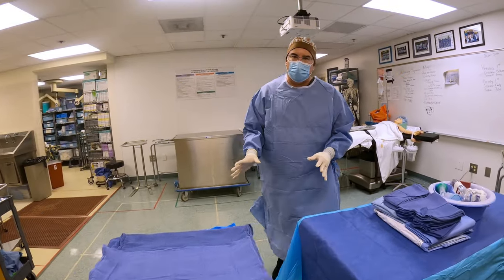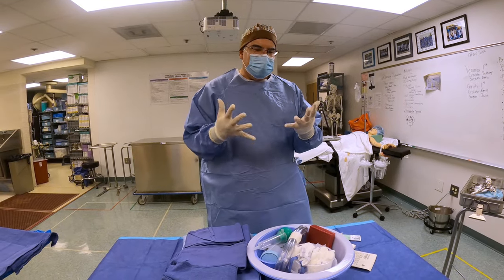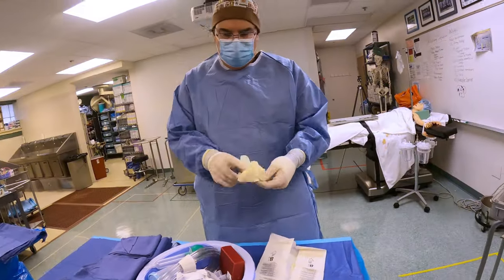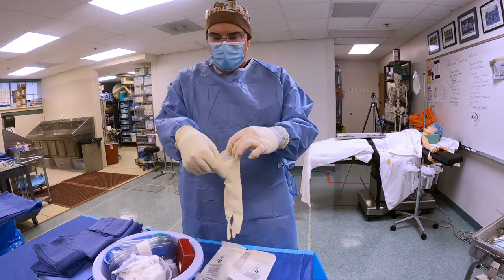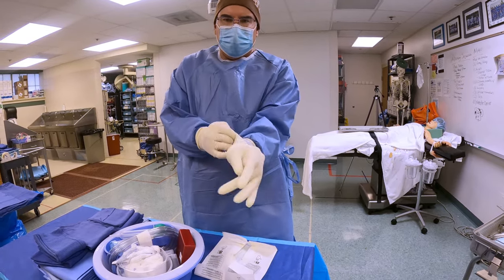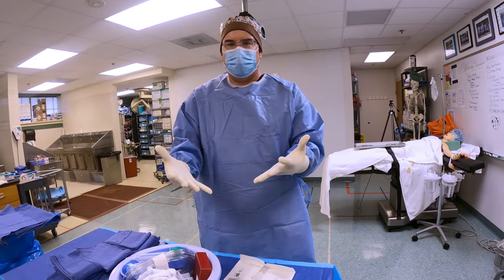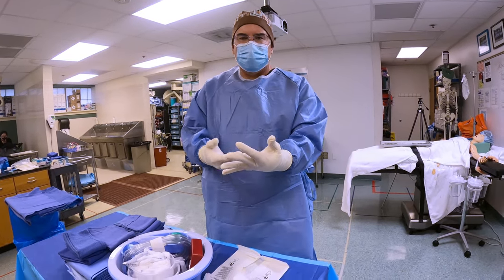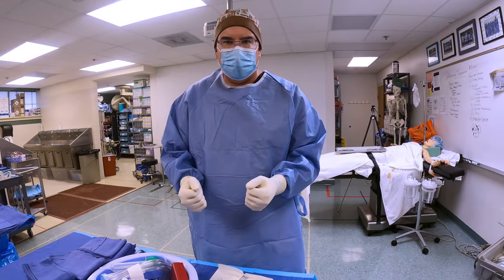Now once I have my mayo stand toweled off, the next thing I'm going to want to do is deal with my instruments. But I don't want to do that yet until I put my second pair of gloves on. The idea of the second pair of gloves is that should my hands become contaminated at any point from this point forward, all I have to do is remove the top pair of gloves.